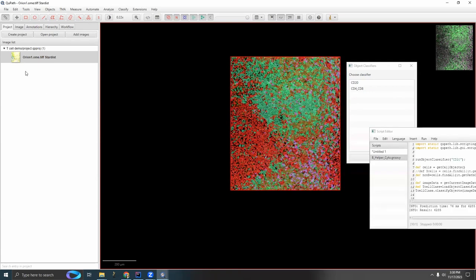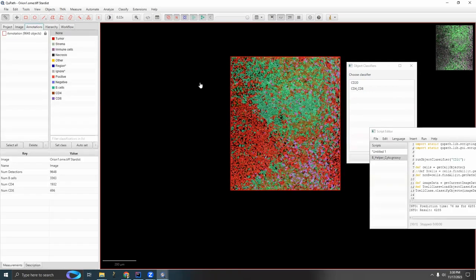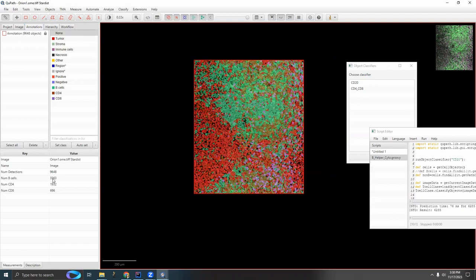Okay, let's see how it looks. Now, if I go into the annotations tab, it's telling me 3,300 total B cells. Sorry, 1900 CD4 is 700 total CD8s. These are the numbers that we got before, but now all of the cells that had been both CD20 and something else have been reclassified as just B cells, and we don't see any of the impossible combinations.